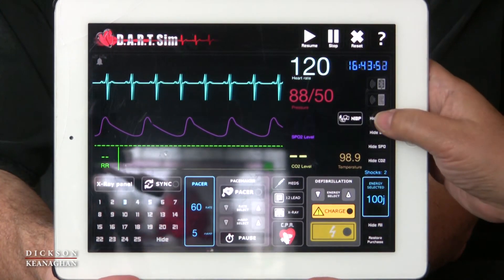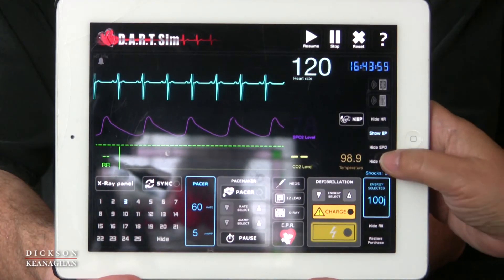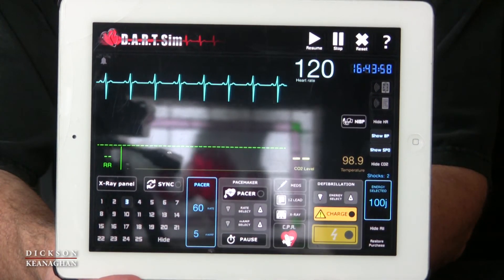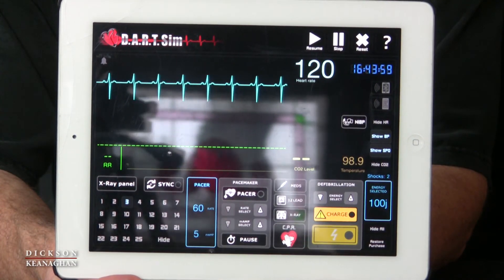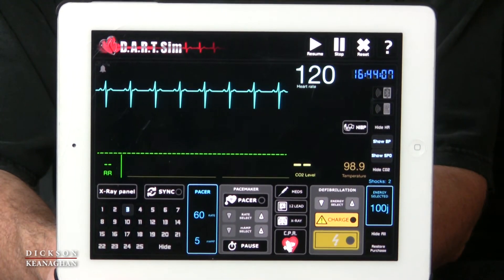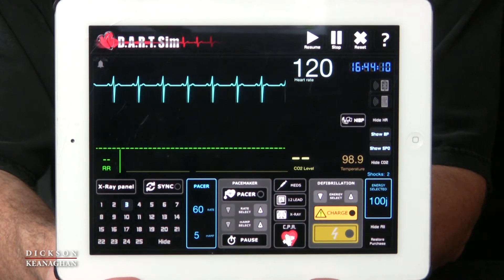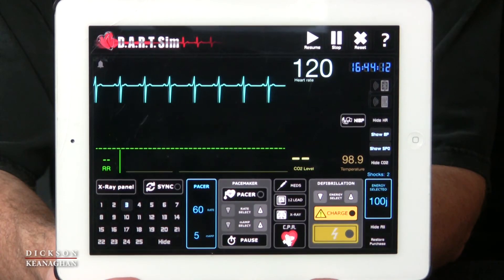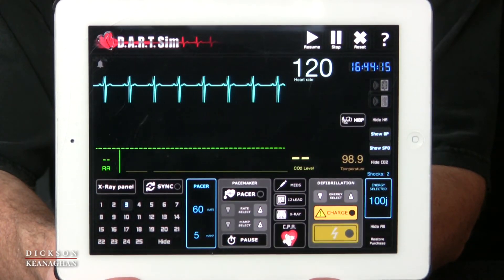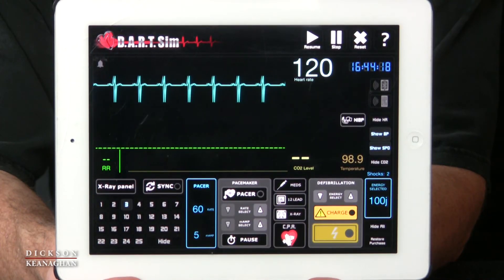And maybe the blood pressure, if we take it again, will improve and all his numbers should improve as soon as his heart rate comes down. Thank you for spending time with me and treating the patient in SVT. I hope you look at my other videos. Thank you.